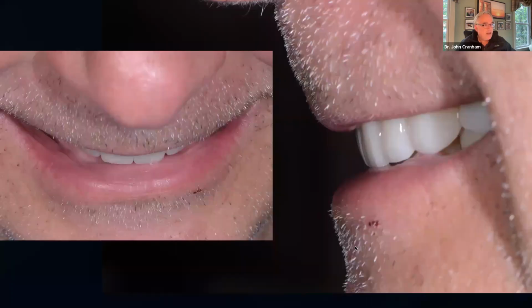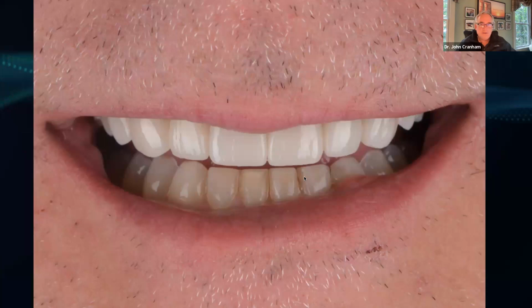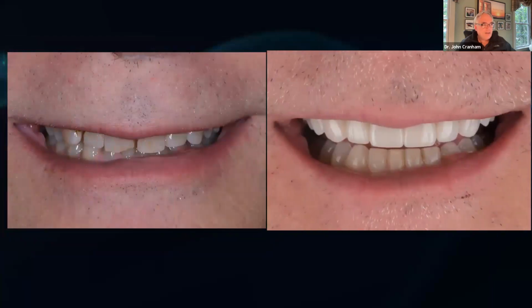Here's a step down smile. Notice how we're following that intervermilion border, which is exactly what we want. Incisal edge is right on that intervermilion border. That's the principle we're shooting for. Notice how pre-op, this was back because of the wear. We're building it back out. There's a nice smile, and again, keying off of that one central incisor, tooth number 9, which I keyed on.